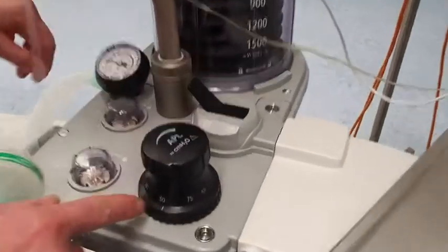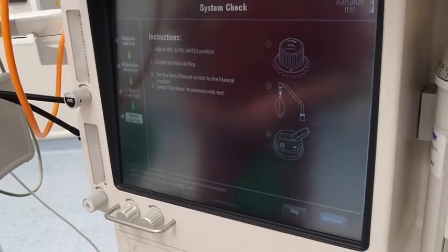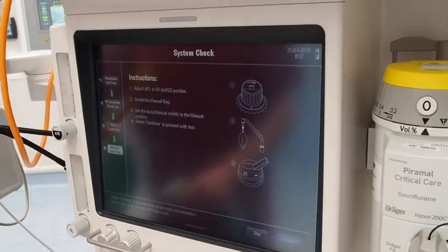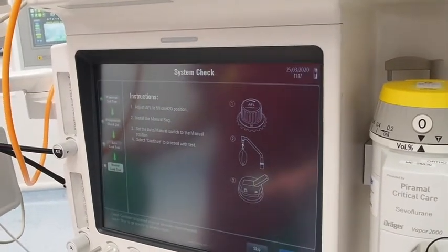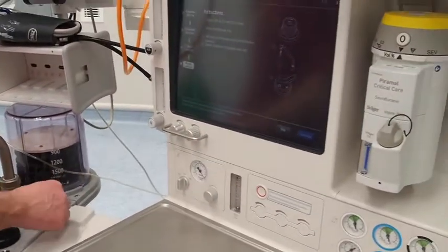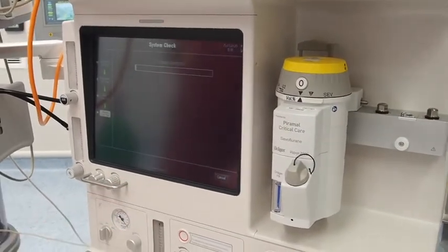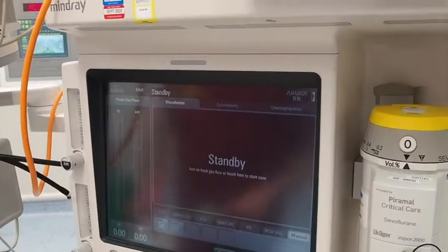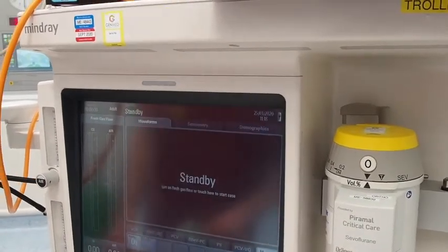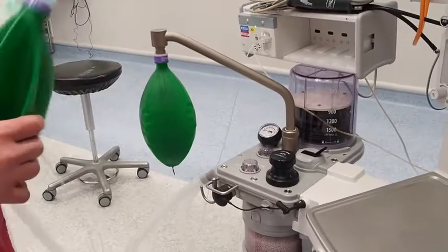We've got a manual bag on. Sorry, the manual bag is a bag on here because this may not come with a bag on already. And then we press continue with this in the manual position. I'm just working through what this tells me in the instructions on the screen. It's checked and ready. So we open up the APL valve. I'm going to put all this onto the bag here just so people understand what's happening.